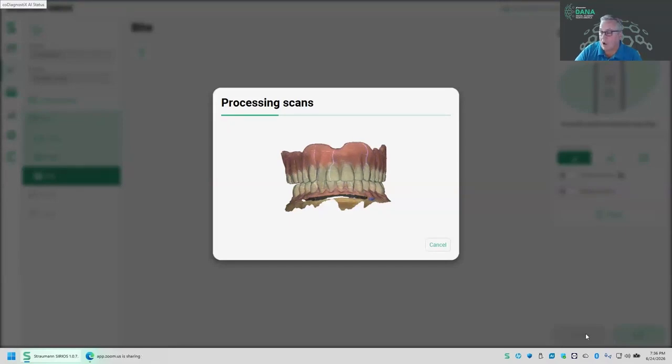So that is the most common denture scenario. Patient comes in with an existing denture. You're going to do a wash impression. Obviously, I got no impression material in here, but if I did, that will only make the capturing of the tag even easier because the impression materials are easy to scan. But yeah, that workflow would hold true for anyone that comes in with an existing denture.